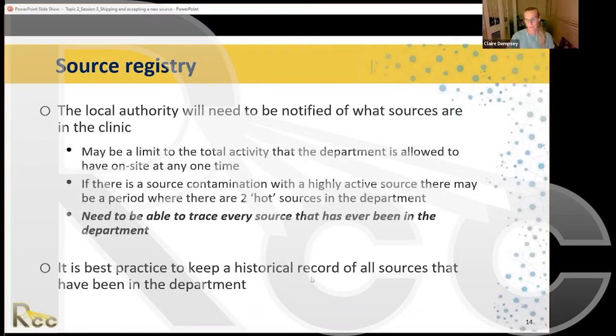As an example, can you give a brief description about the safe transport of iridium-192? Yes. So when the iridium arrives by airplane in the country and it goes through customs clearance because you've got all your documentation in place, that's all great. You should be in contact with the manufacturer. It's really important that you are constantly talking to the manufacturer. So for iridium, let's say we're working with Elekta.